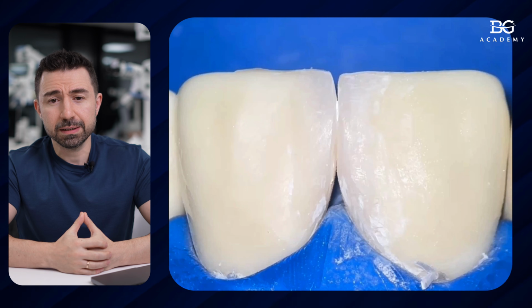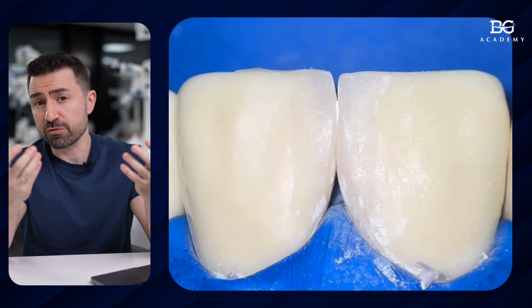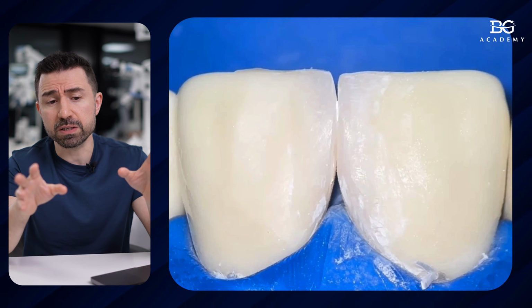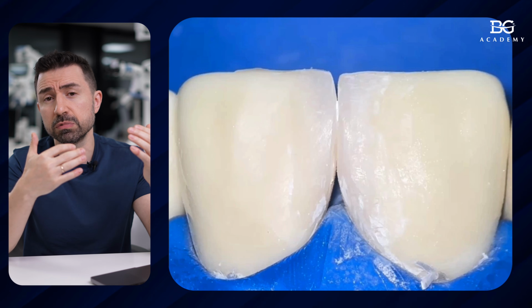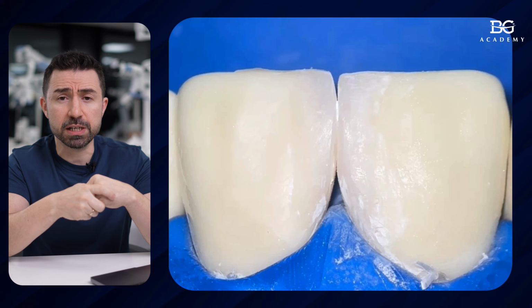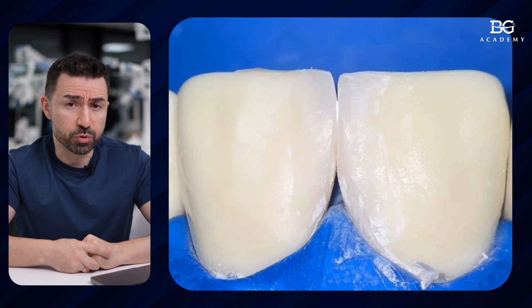Dear colleagues, sometimes it happens when you do, for example, diastema closure using composite material, or adjacent class 3 or class 4 restorations or composite veneers, doesn't matter. And sometimes one tooth profile becomes progressive, one becomes, let's say, negative, and the midline really doesn't look nice, okay? So how to manage this, I would like to share with you during this small presentation.